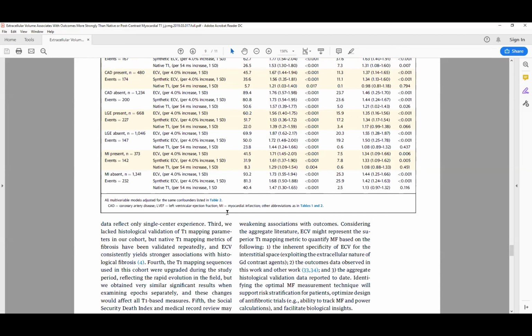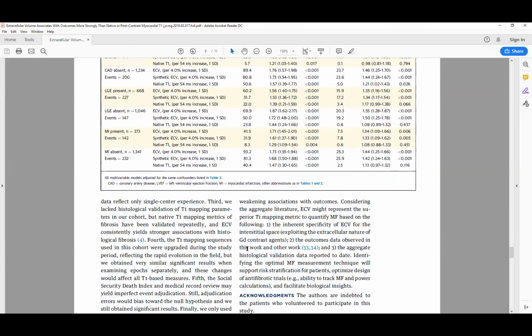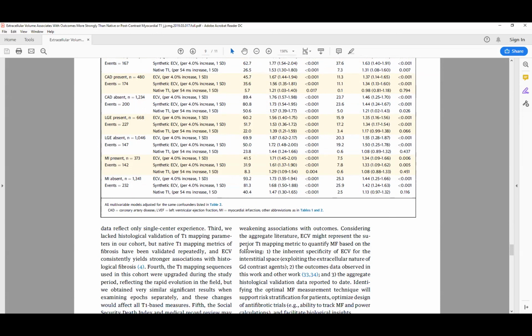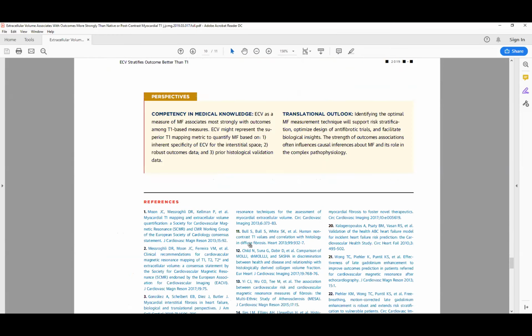There was a recent study that just came out that showed that diabetic control can affect native T1 without influencing ECV. I forgot to have that paper pulled up prior to the meeting. But essentially, I think if one measures the interstitium, which is where myocardial fibrosis and, of course, amyloidosis reside, it makes sense to measure the interstitium with the least amount of confounding possible. And I think that measure that we have is ECV, and that's essentially what the paper was about.